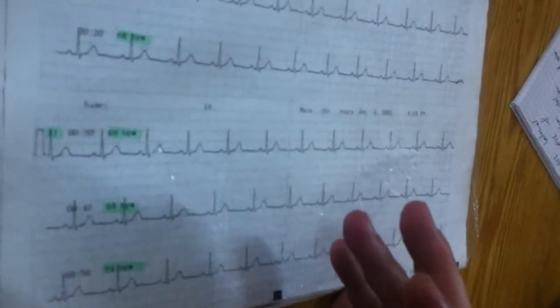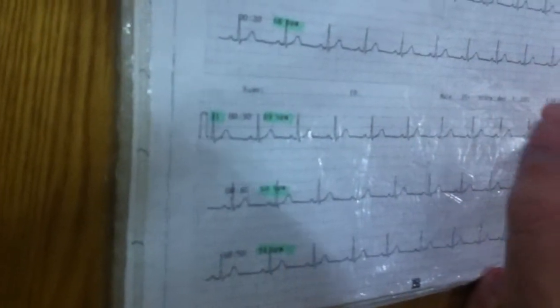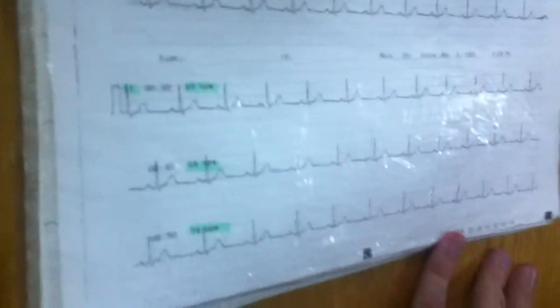What is the second lead? There are no leads. It's only a rhythm strip in the second standard lead. Maybe too fast or too slow? There are maybe like 3 squares, just sinus tachycardia.